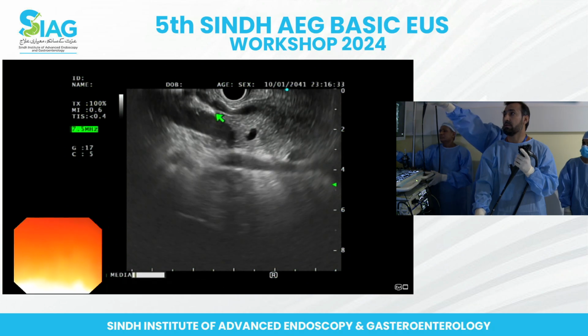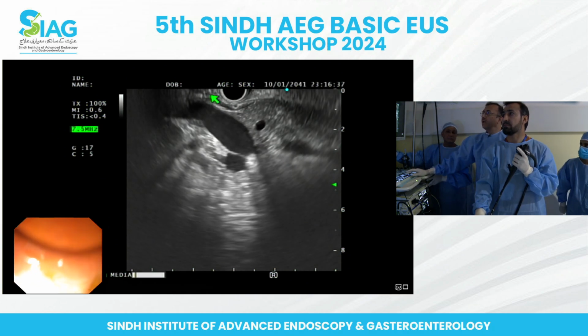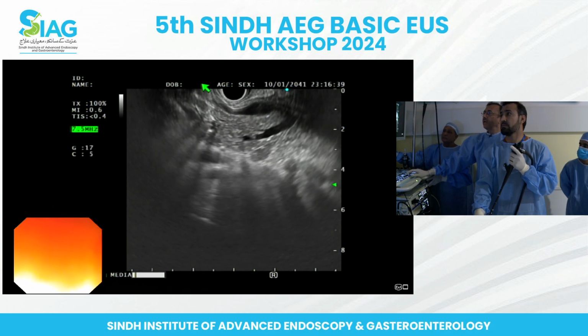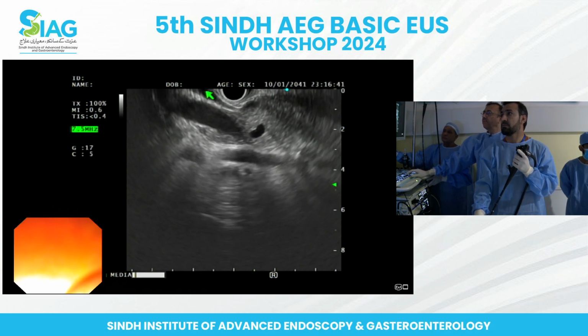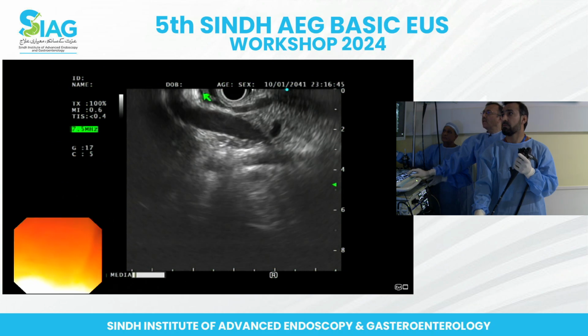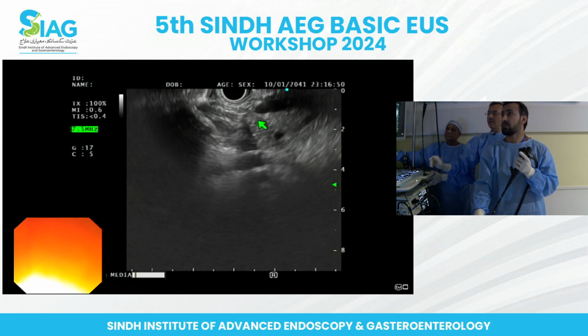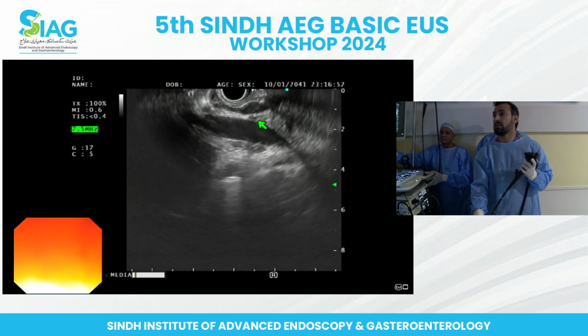Push. See, we are going towards the hilum of the liver, and there you have the division. Big wheel away from you. Slight jiggling. And here comes your right and left, the common hepatic duct dividing into right and left. Okay. Let's go. Now we go to the D2.